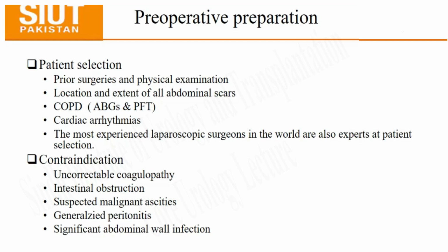What we realized is that the learning curve of robotic surgery is easier than the laparoscopic, because if I ask anybody over here in this room to suture on a robot, they will eventually in 5 minutes. But if I ask them to suture on a laparoscopic model, it will take them hours, at least hours to suture. So the biggest advantage of robotic surgery is that the learning curve is a bit less than laparoscopic.